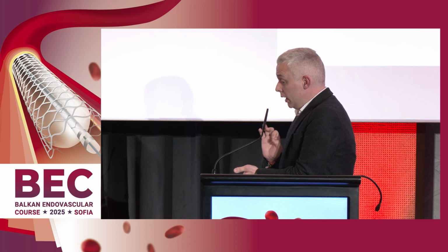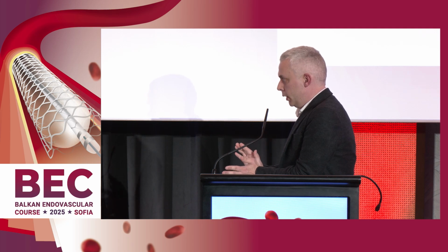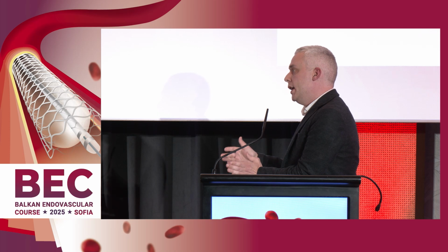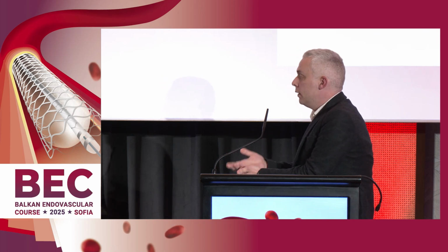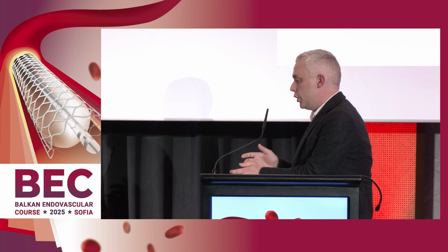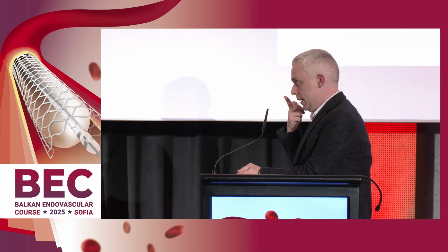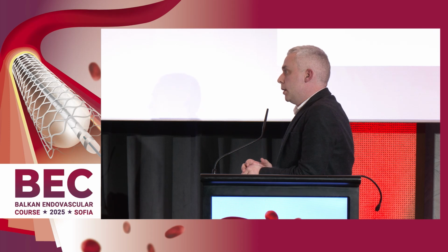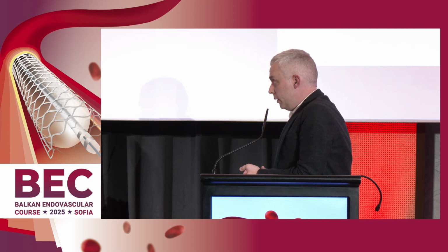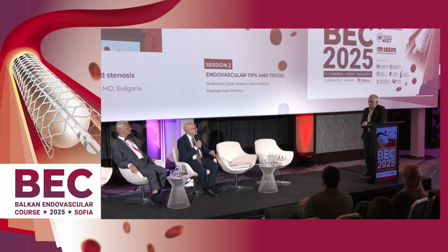A little thing, you do something that is actually controversial, that is actually against the guidelines. So anything that can support the idea for the treatment, and anything that can add safety considerations such as excluding thrombus inside is good. Unfortunately, this makes the procedure itself expensive. It's not obligatory to have a CT, for example, just to clarify whether it's a thrombus-containing lesion or not.